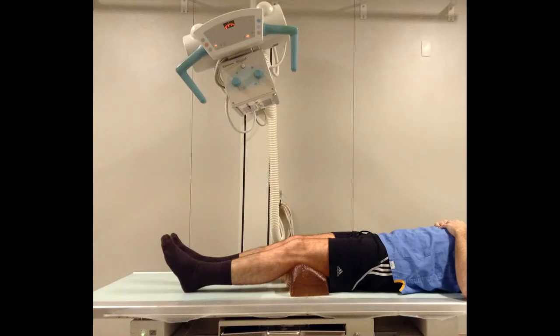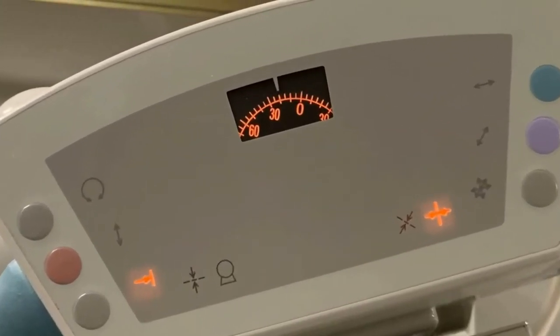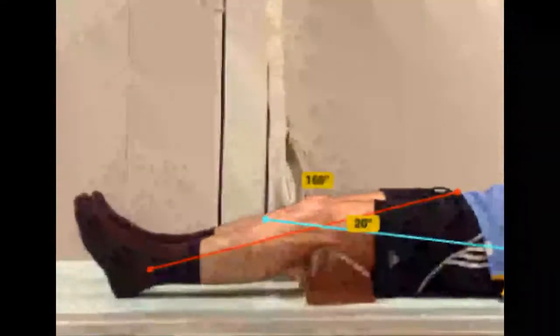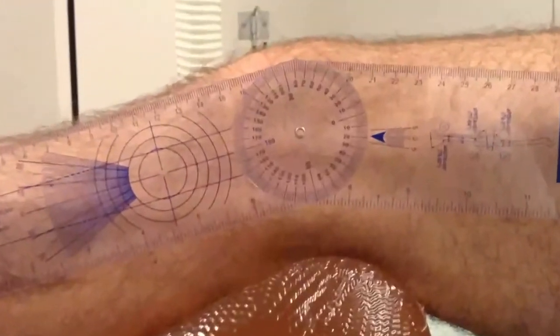The patient is placed in the supine position with the X-ray ampoule angled at about 20 degrees cephalic, the same angle at which the knee should be flexed. We use the Bone Ninja app to check if the patient has 20 degrees of flexion, and we can also use a traditional goniometer to verify these 20-degree measurements.